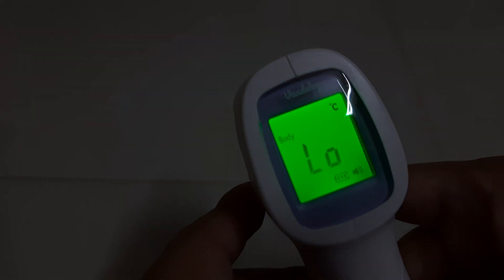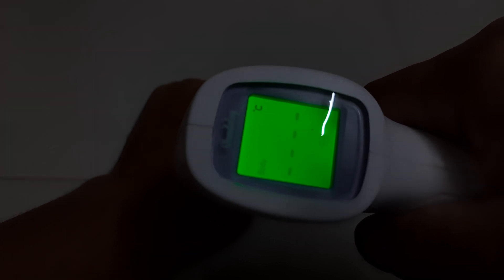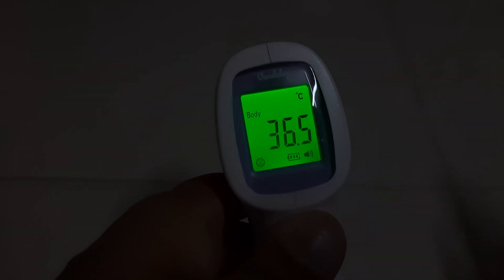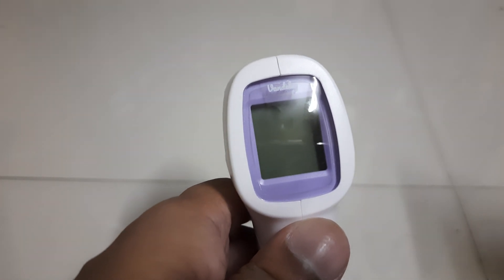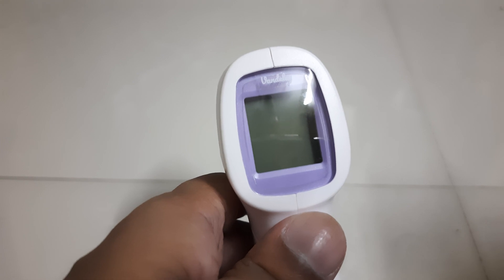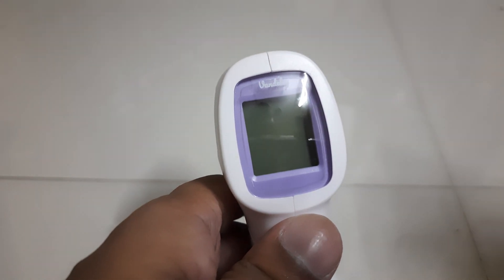Let's check my body temperature right now. I'll just keep my hand and show you — it's reading 36.5°C, so that's a normal temperature, which is why it's showing green. If it were around 37°C it would go orange, meaning fever is starting, and if it's around 38°C or above it would turn red, which is the alert.